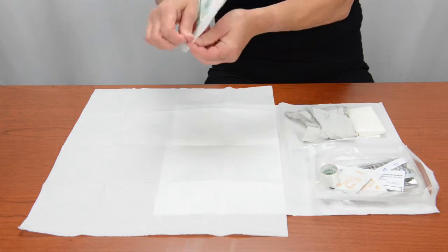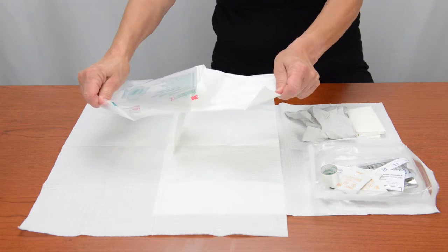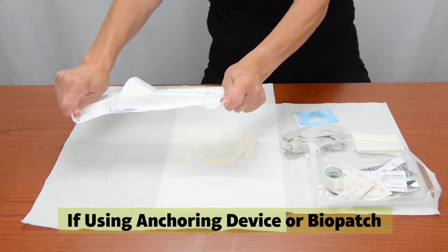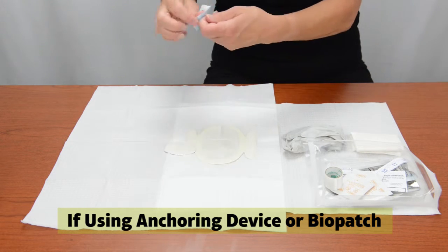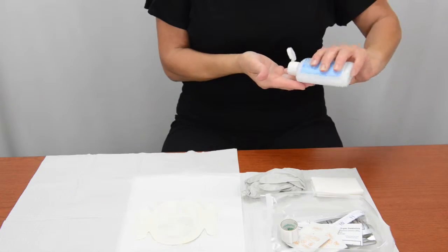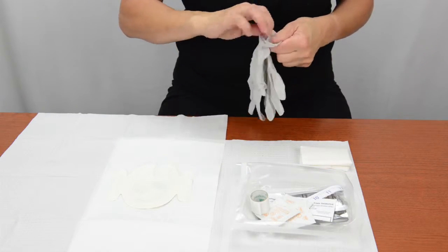Peel open the clear bandage package and let the bandage fall from the package onto the drape. Do not touch the clear bandage with your fingers or anything that is not sterile. Repeat this process with the anchoring device and the biopatch if you are using them. Clean your hands with alcohol-based hand sanitizer, then put on the non-sterile gloves.